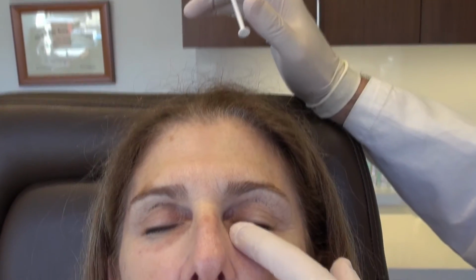And if there's issues with this, I found that dissolving it with hyaluronidase is really very simple, not a big deal. But the reason why I'm using dilute Juvederm, by the way, is what the saline does is hydrate the hyaluronic acid of the Juvederm. Open your eyes, come forward. That's good.